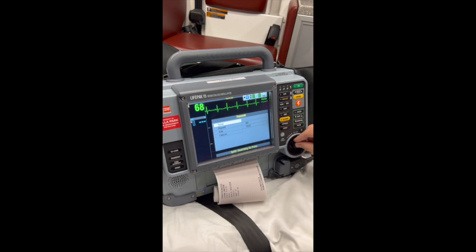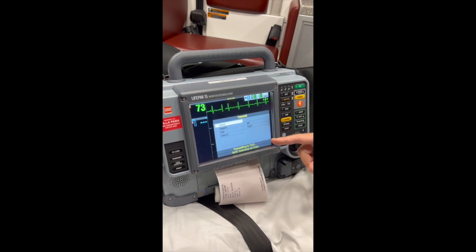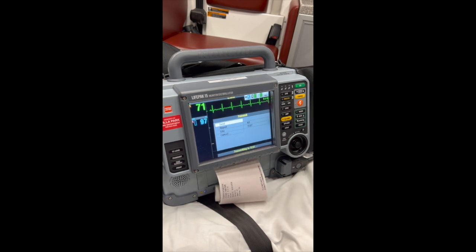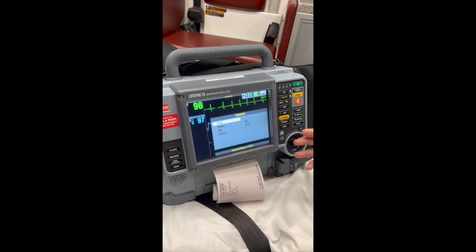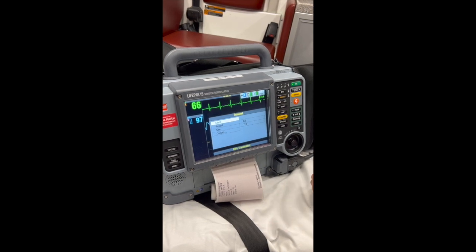Now come up and send. What we're looking for is the monitor is going to send a signal out to the LifePak cloud, and if it makes a connection there, we know that the monitor is sending out to that point. The problem is not with our connection, it's with either the hospital side or with ImageTrend at that point.